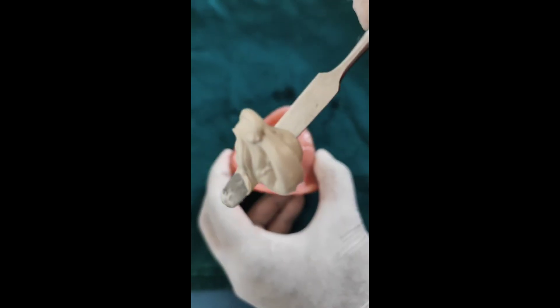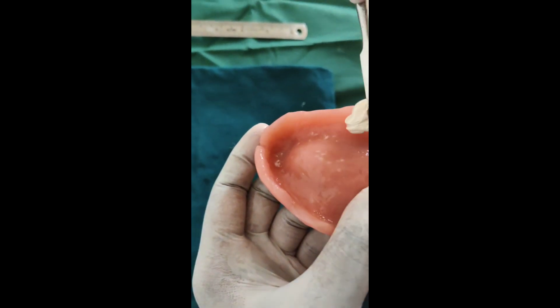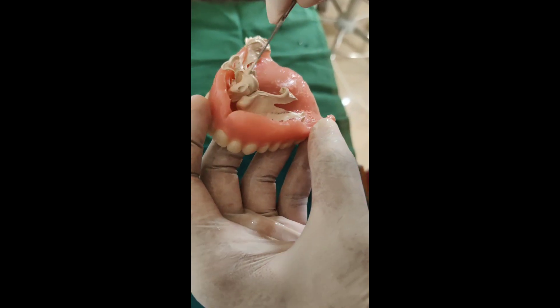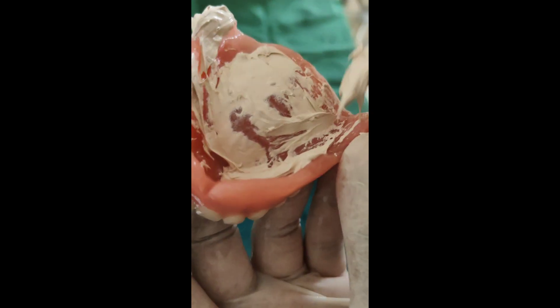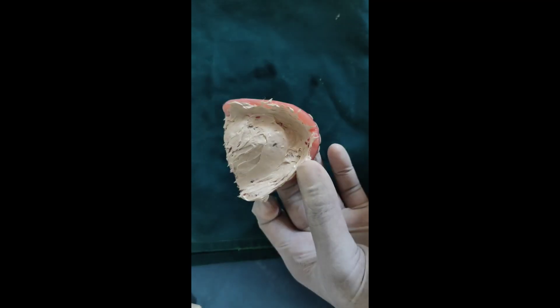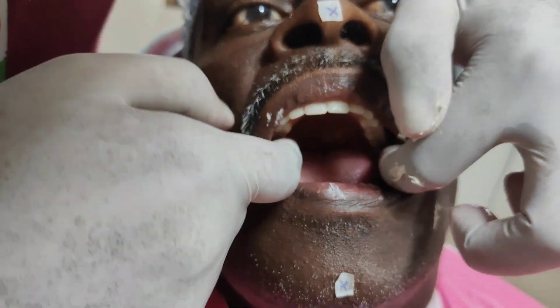After checking peripheral adaptation, the extension of the maxillary denture is checked. The base paste of zinc oxide eugenol impression paste is coated uniformly and evenly over the intaglio surface of the denture to indicate any pressure spots that could cause irritation of the mucosa and to detect any overextension. It is then placed inside the patient's mouth.